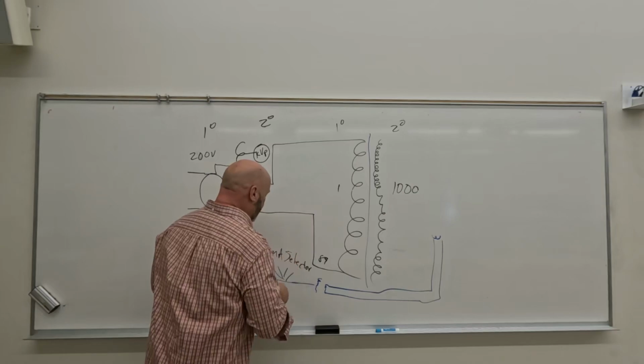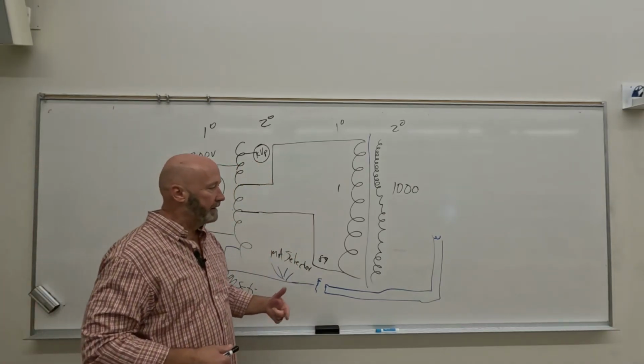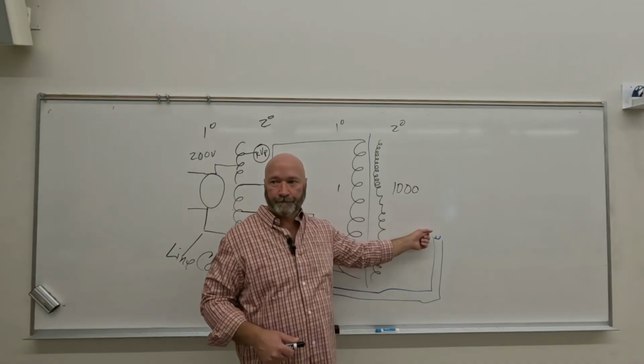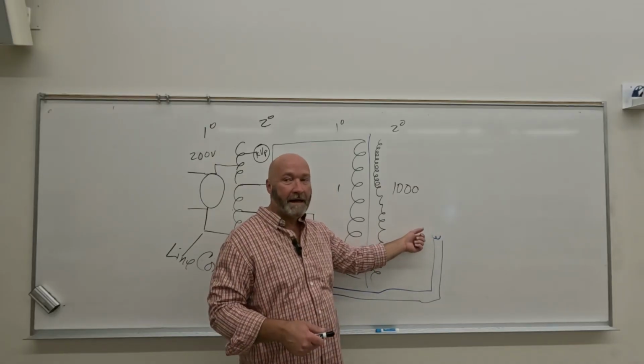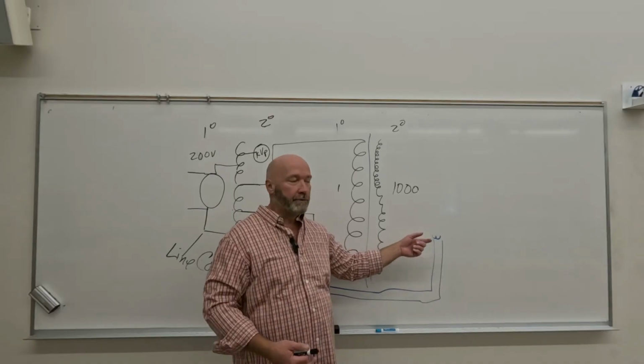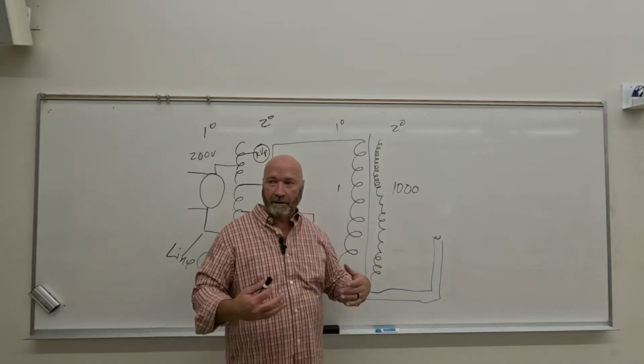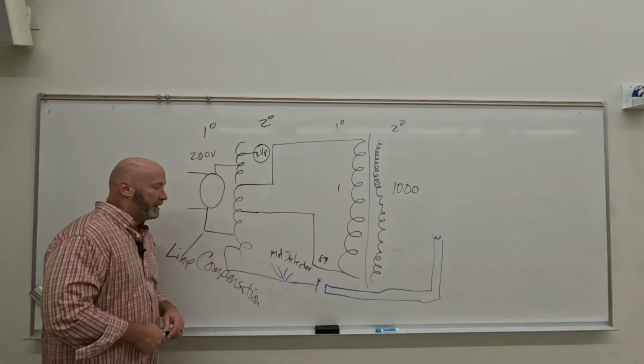What this is going to do is give us the amperage that we need to heat up the filament. Okay, remembering that we don't have mAs until we make an exposure. We add in the time, we create the exposure, then we have mAs. But at this point, we're just creating thermionic emission, that electron cloud, right?